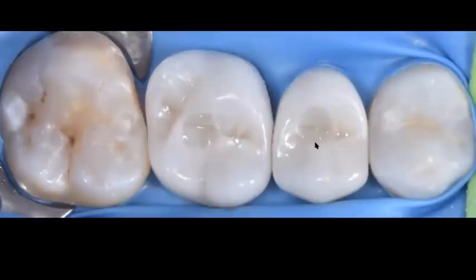This particular case was restored with Brilliant EverGlow, and I'm using the opaque dentin shade, and I try to match the shade of the zirconia. In this particular case, this was A2. So I'm going to add an opaque A2. And you can see that in that opaque A2, that is one single layer, I have used my core packer to indent that layer and create some areas for my stains so that I can continue with the natural stains that the lab was able to give these restorations. And you can see I've done the same here on the premolar.